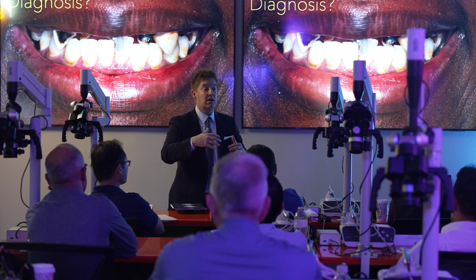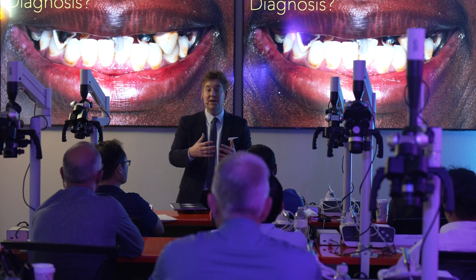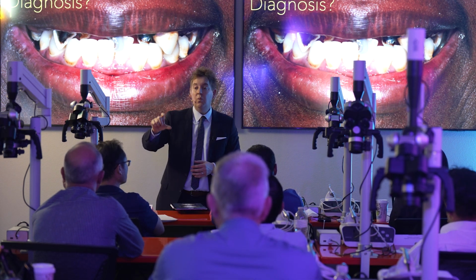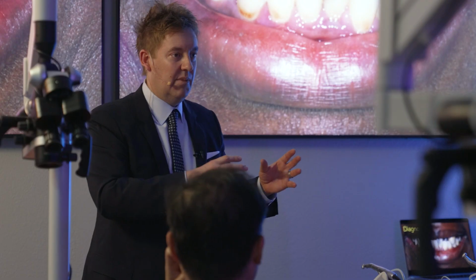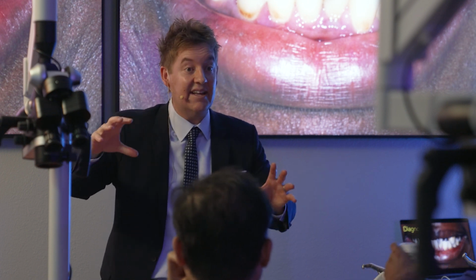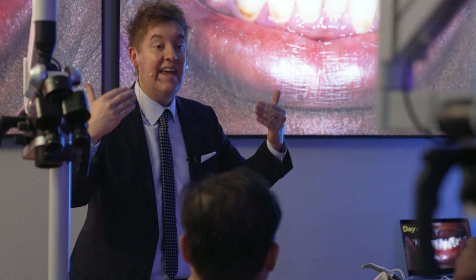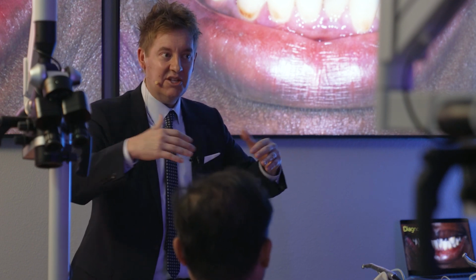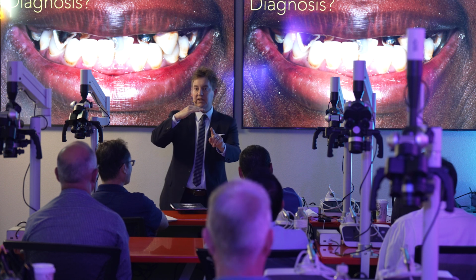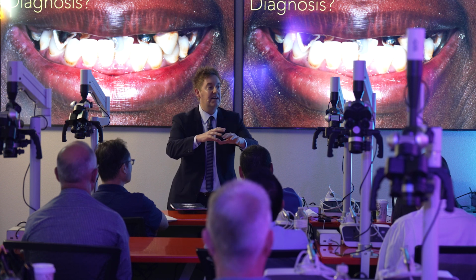It's very common when I'm teaching occlusion courses that dentists come up to me with a set of models and say, hey, JB, can you help me treatment plan my patient? And what do the models always have? But you have to understand, you're never going to get the answer by looking at the study models or the radiographs or the scans, because the answer of where tooth positions should go lives in their face. Okay? So we need a starting point. It's always the maxillary central incisor, incisal edge position relative to their face. It's exactly how you all set up a denture.